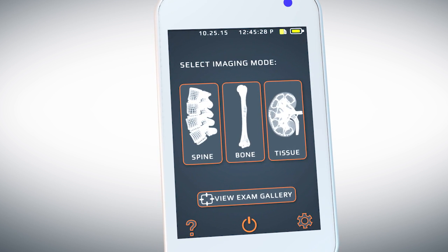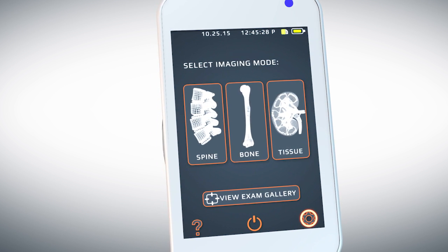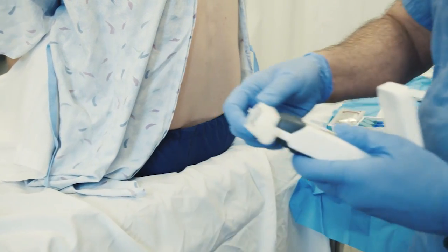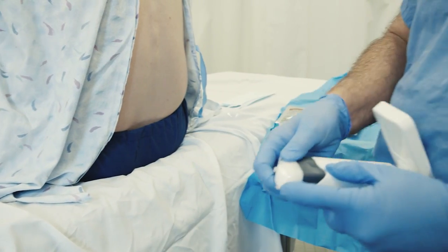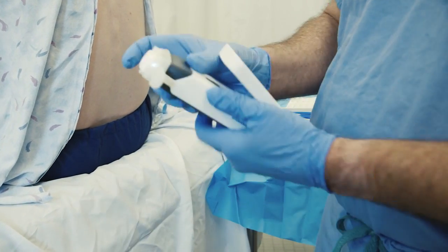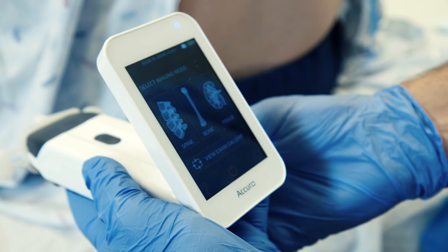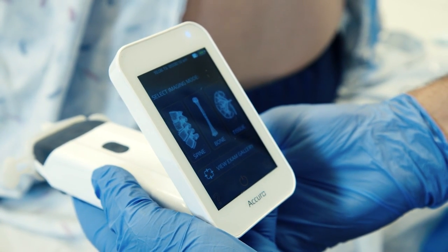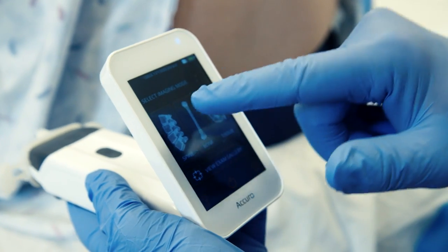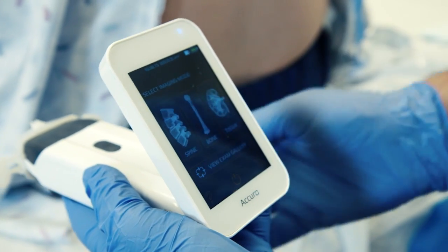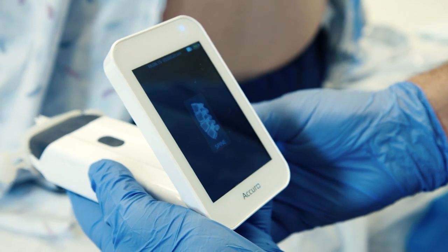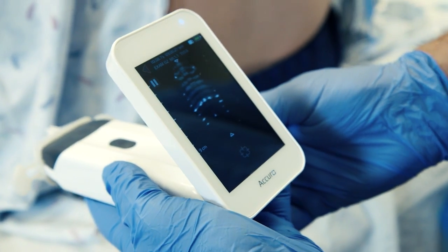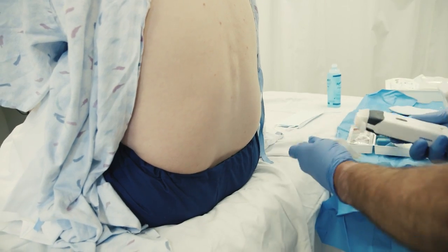The Acuro device settings can be accessed using the settings button on the bottom right. If using the Ravana locator needle guide, place the locator onto the Acuro to guide a spinal or epidural anesthesia related procedure. Select the spine icon — this preset activates the Acuro's SpineNav 3D technology, which automates identification of epidural location and depth.